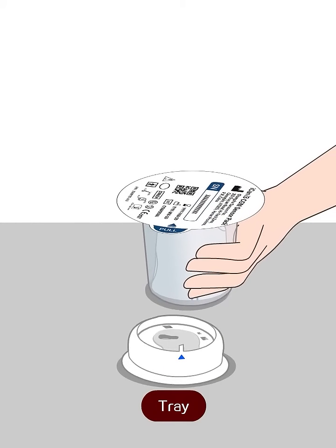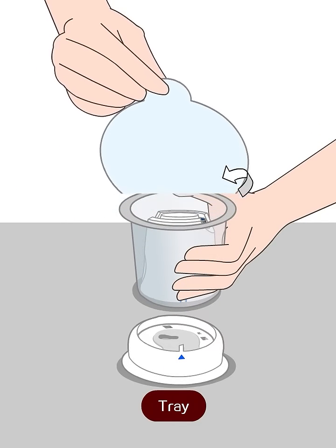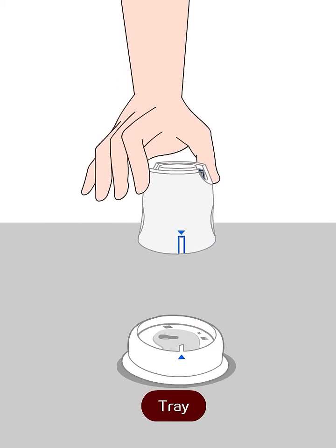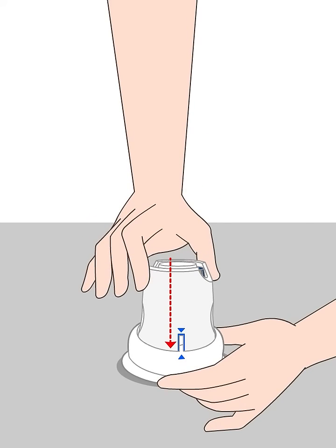Place the tray on a firm and flat table, remove the packaging film, and take out the sensor applicator. Align the blue mark on the sensor applicator with the mark on the transmitter tray.